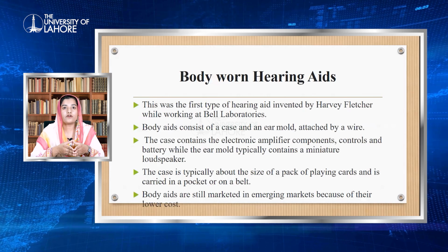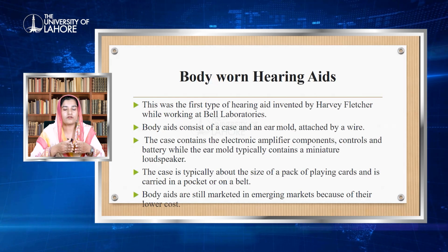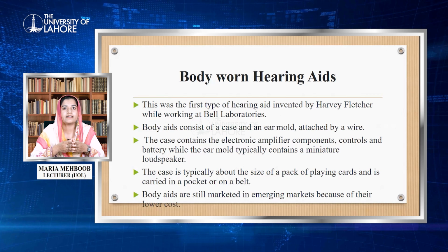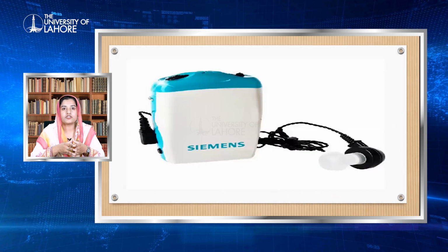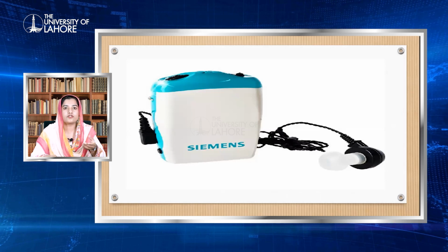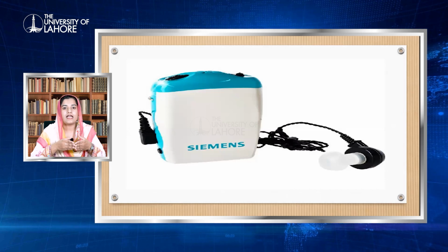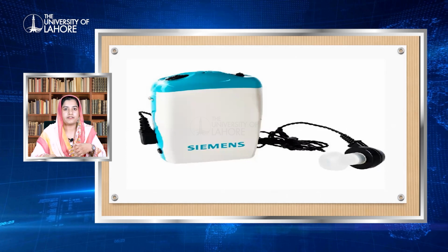First of all, the body-worn hearing aid was used by people before this fast technology era. In this fast technology era, people mostly use programmable hearing aids. This is not a programmable hearing aid. This body-worn hearing aid is basically, you can say, a pack of playing cards. You can see in this picture, this is the body-worn hearing aid compartment, and a receiver is connected to a cord. This was used by people with a profound degree of hearing loss, and this is not a digital hearing aid. It is only an analog hearing aid, which simply receives the signal and then converts it into an electrical signal and then again into an acoustic signal, which is received by the patient.